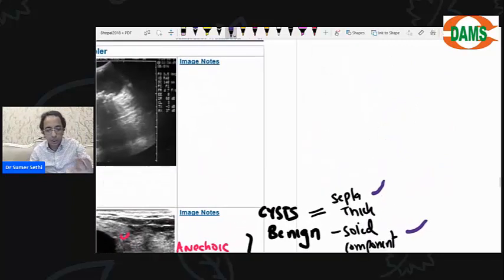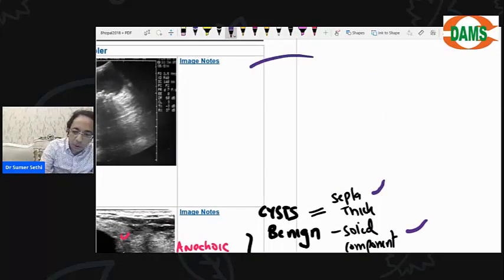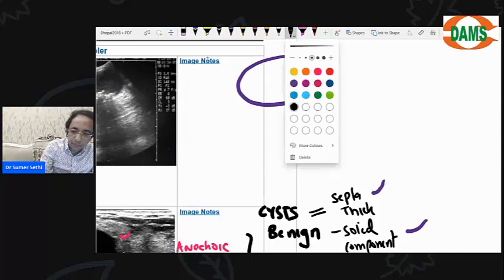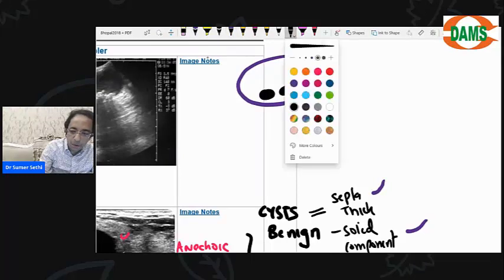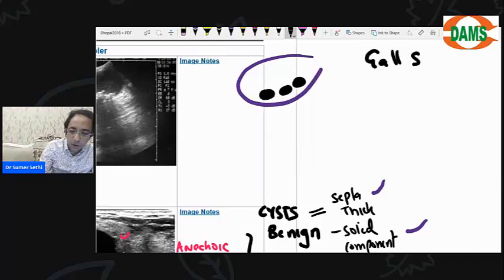Now let's see the second concept. Suppose this is your gallbladder, and in the gallbladder there is a stone. So I will call them gallstones. Suppose I send sound into the body, sound goes and strikes the gallstones, gets reflected back.